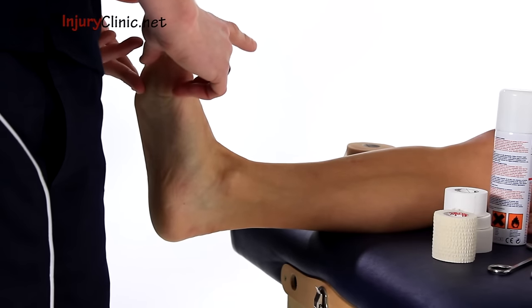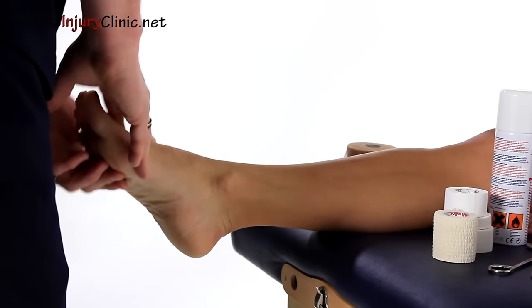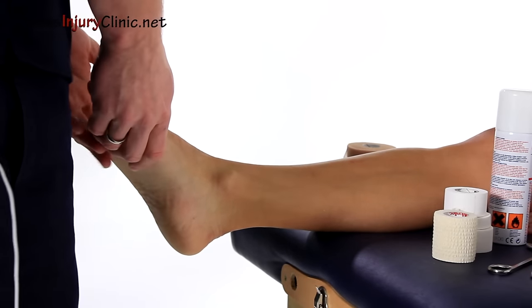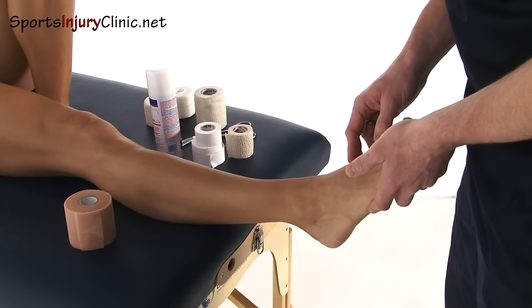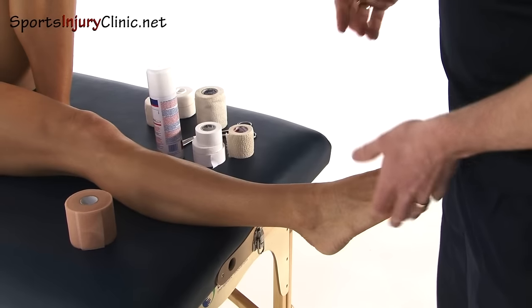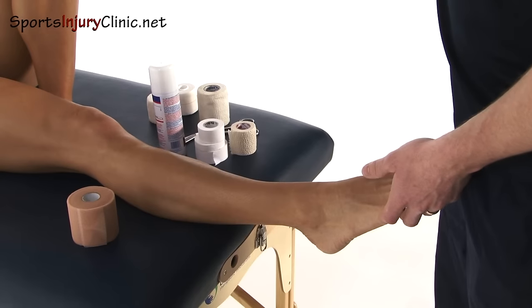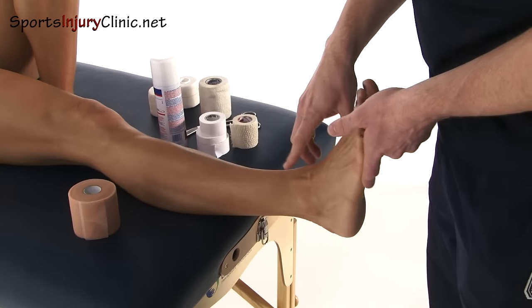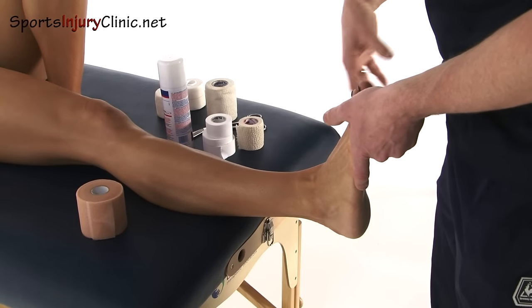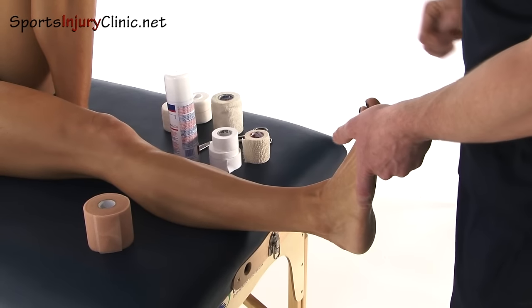What's quite key is that the patient holds their foot in position. If they start to relax it, the strapping goes on too loose and you have to redo it. When you do a strapping it already loosens anyway, so it's important to get the tightness right from the start. Equally, if you put it on too tight, they won't be able to wear it. So you've got to get a fine balance between the two.